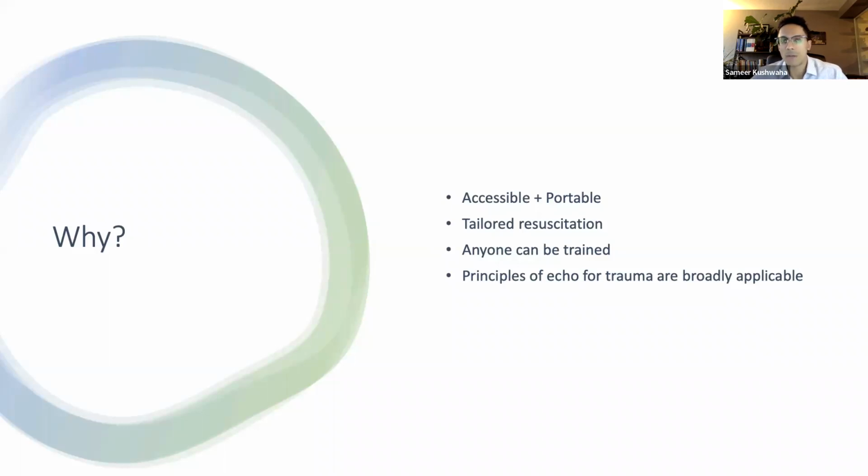We also, in cardiology, and our sonographers also teach many other specialists and future subspecialists outside of cardiology. So it's important to get a sense of some other applications that our colleagues might be using echo and ultrasonography for in the future. And also the principles of echo for trauma can be expanded to a lot of other situations that we commonly deal with, such as the management of patients in the peri-procedural or peri-operative setting, or people coming into the CCU or wards with undifferentiated shock.